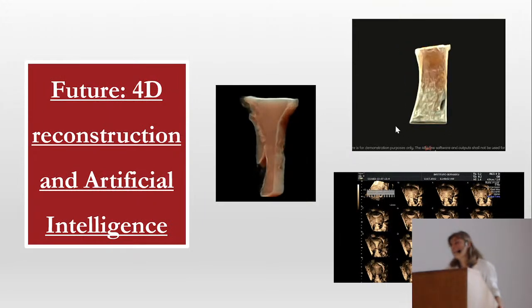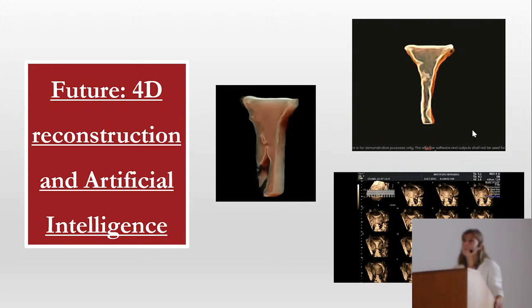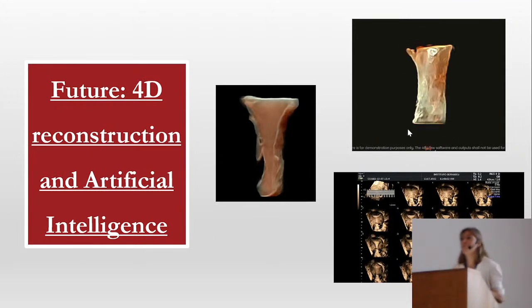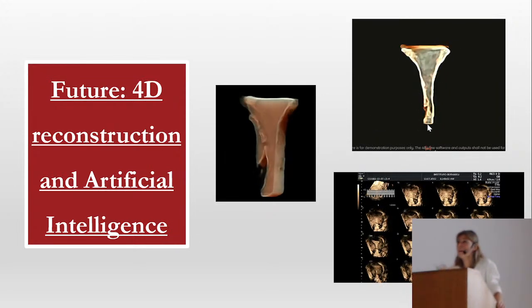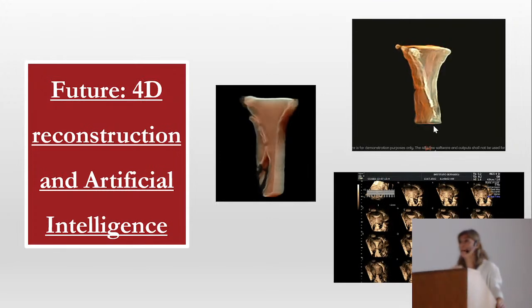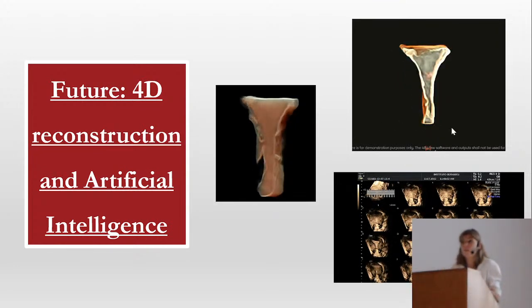Okay, and then I'm obsessed with that, because my problem is I wanted to improve the 2D. Okay, I'm doing 4D. This is amazing. It's not. I'm only assessing one slice of the uterus. Anyway, it's a coronal view, but it's 2D again. So I don't want it.